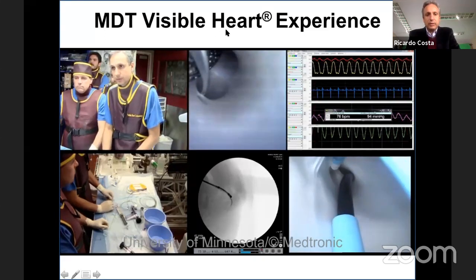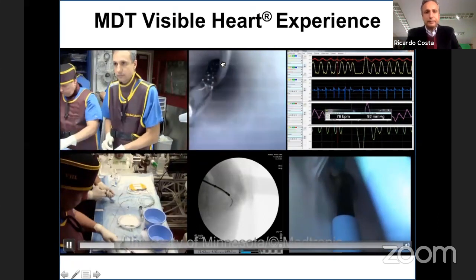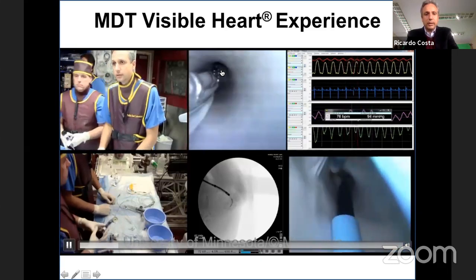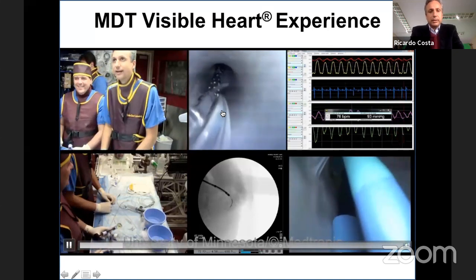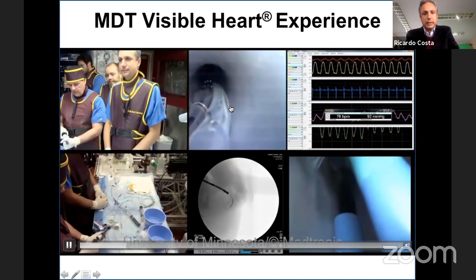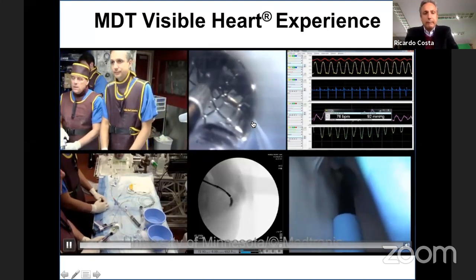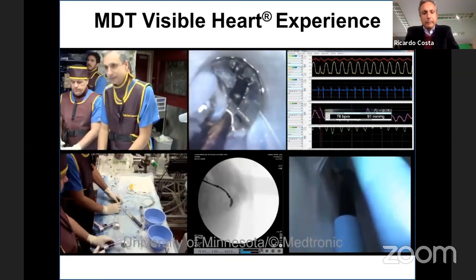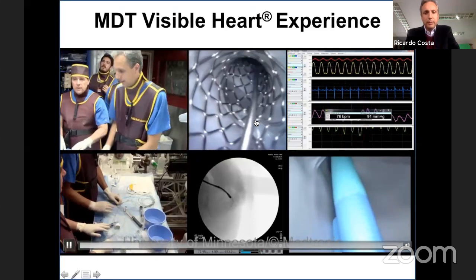So we have stent into the main vessel. I'm sorry, in the side branch, and if you're doing a DK crush, not a nano crush, you're going to have some extent of stent towards the proximal segment of the bifurcation. The balloon is already parked in the main vessel. This is the stent being implanted, okay? So this stent is sized according to the distal reference. And we have a balloon here in the main vessel.